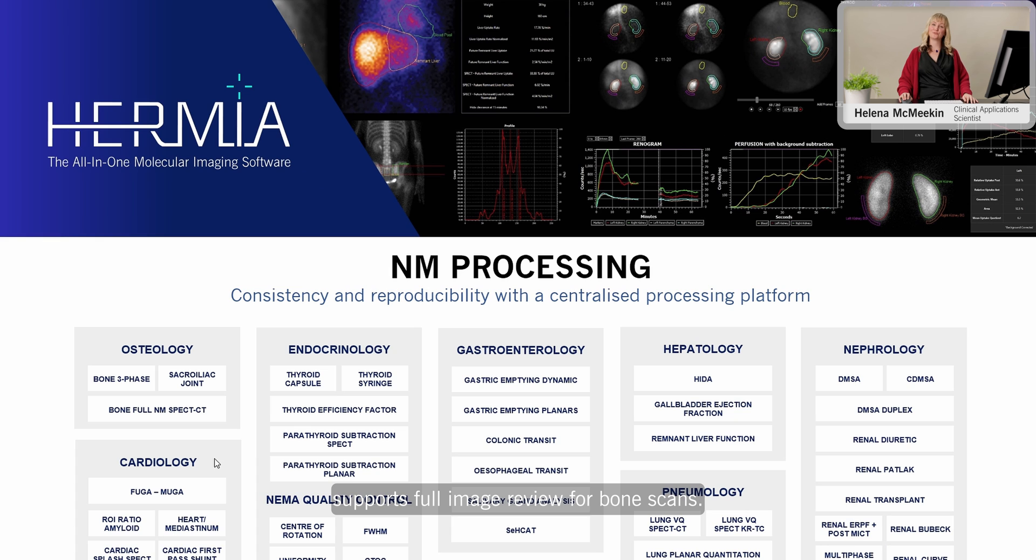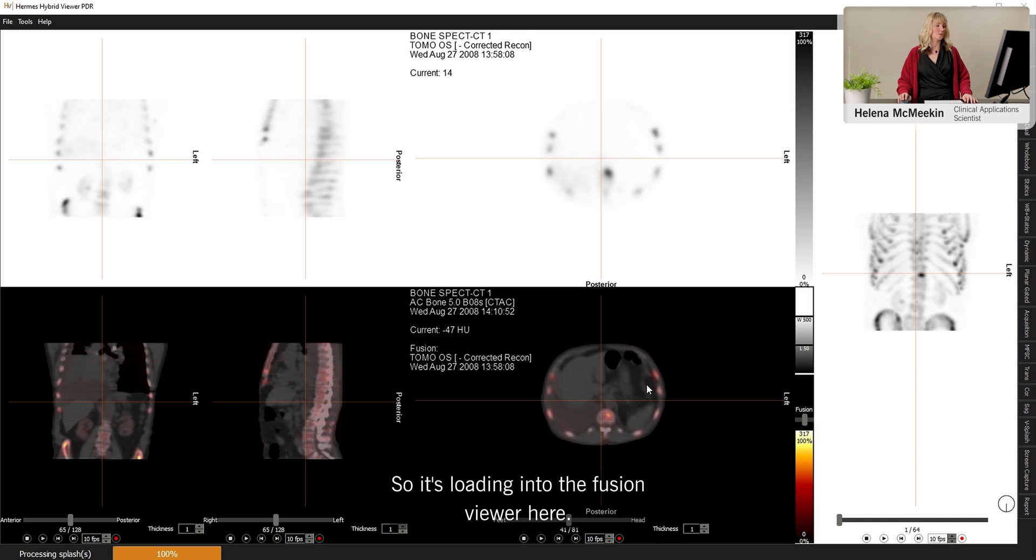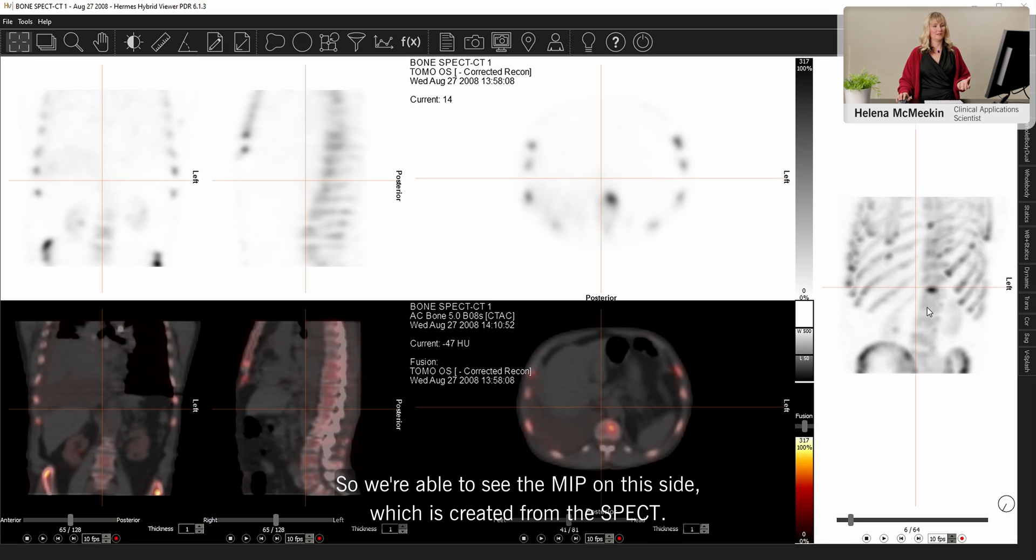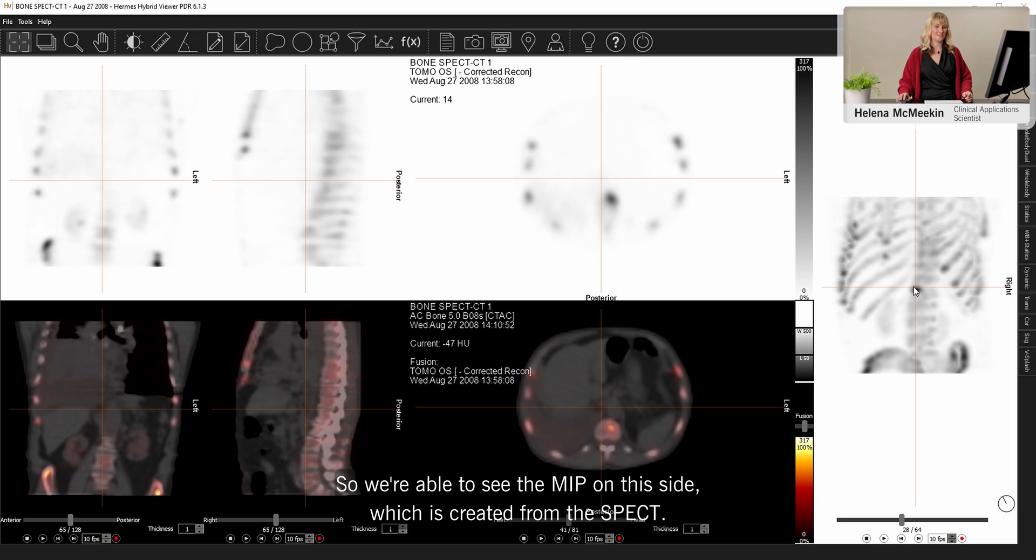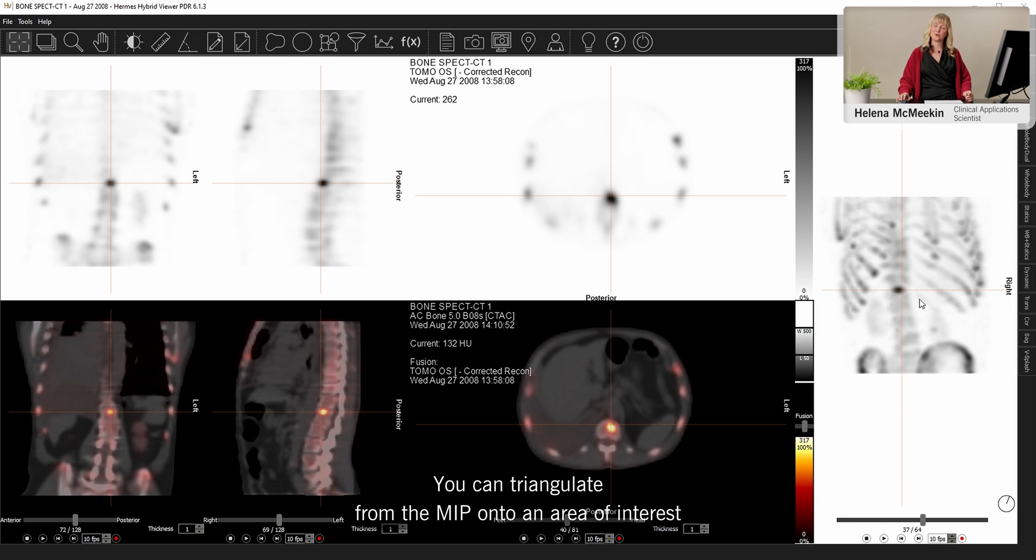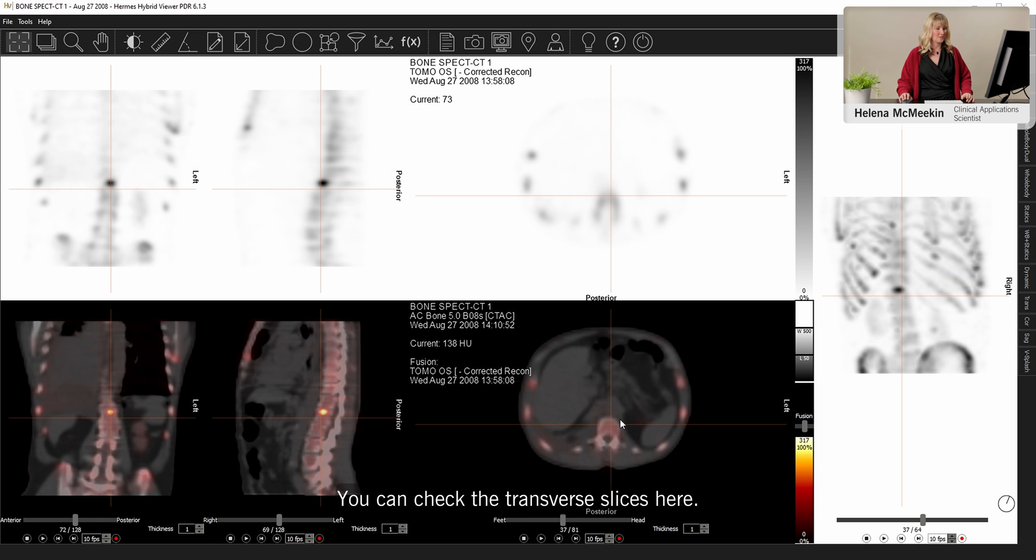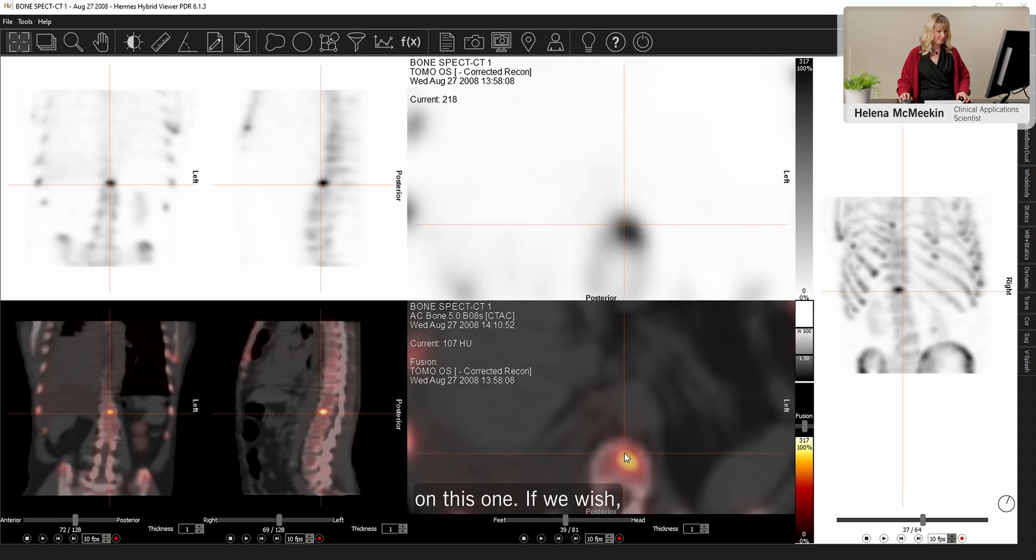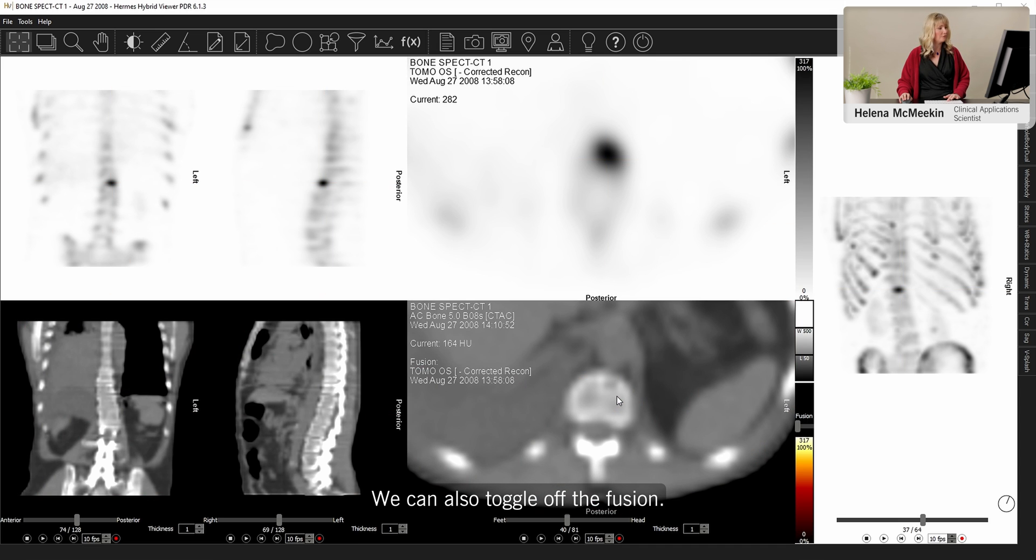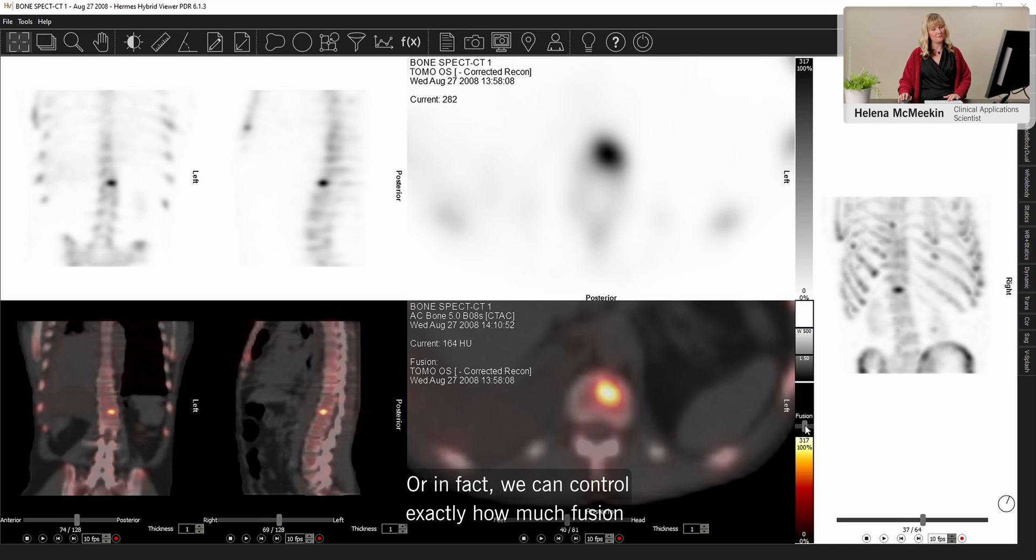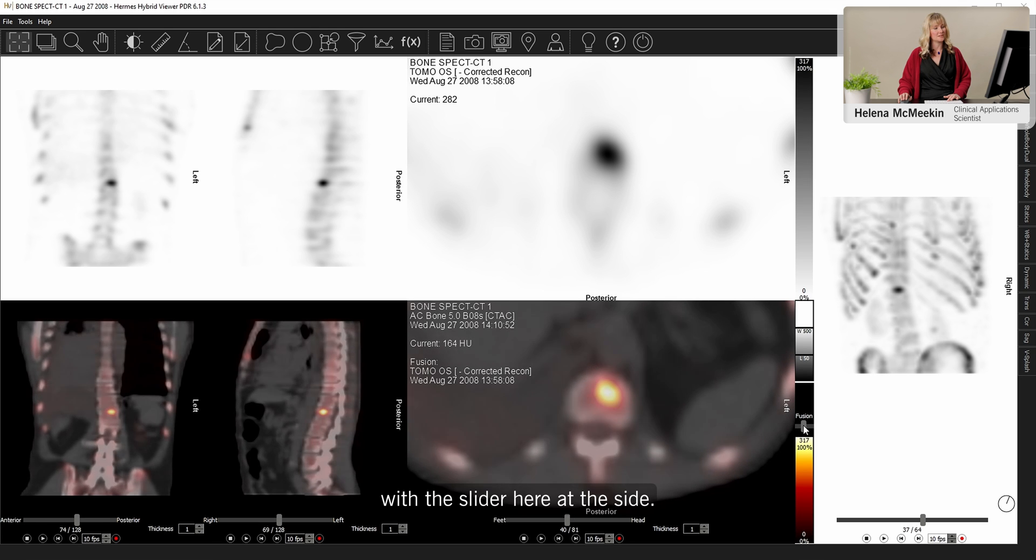Hermia also supports full image review for bone scans. Let's take a look at this case. So it's loading into the fusion viewer here. So we're able to see the MIP on this side, which is created from the SPECT. You can triangulate from the MIP onto an area of interest and that triangulation point is then maintained on these slices. You can check the transverse slices here. Zoom in on this one. If we wish, we can hide the cursor. We can also toggle off the fusion. So if we want to take a look at the CT underneath, it's very easy to do that. Or in fact, we can control exactly how much fusion with this slider at the side here.